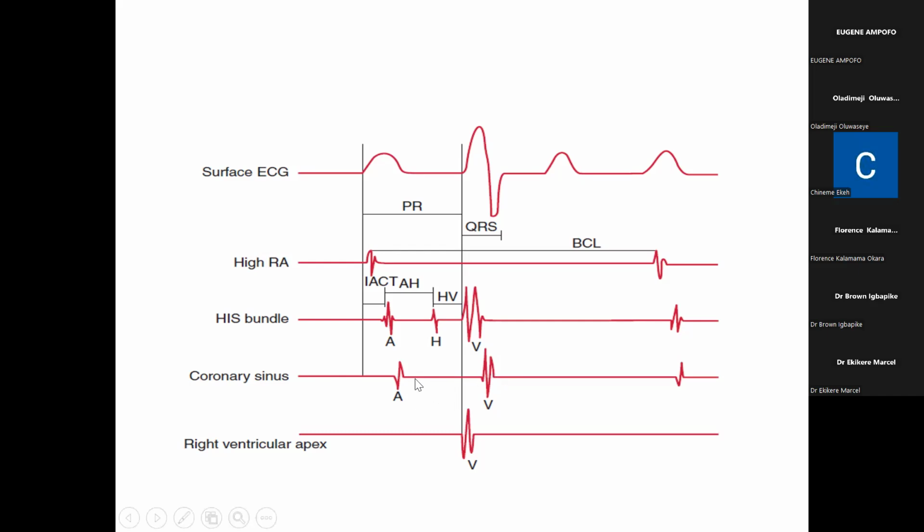Yes, sir. So left atrium, how will you know? Because it's corresponding with your P wave, right? Remember the P wave, always remember your surface ECG is a summation of whatever is happening in that chamber of the heart it's representing. So P wave represents both right and left atrium, right?